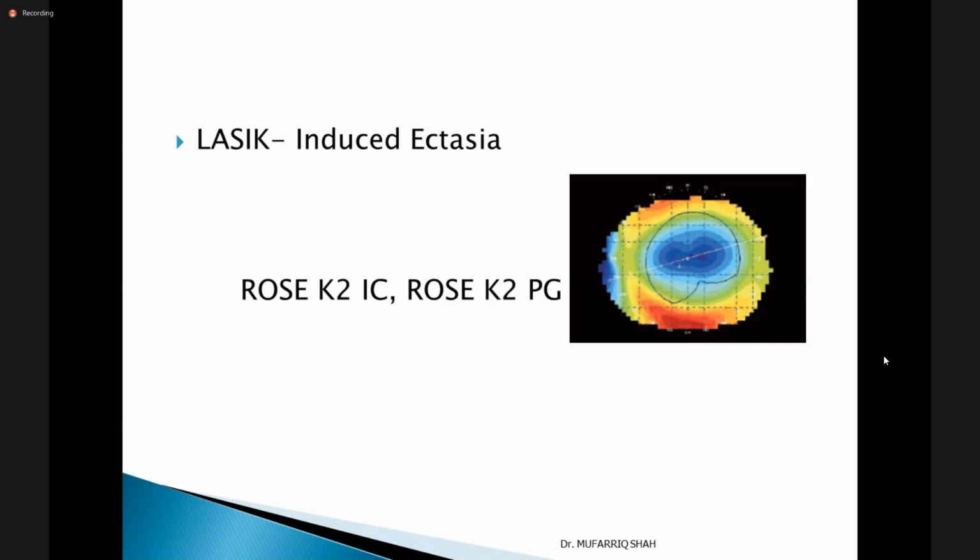So in this case, Rose K2 simple, that is the steeper base curve and smaller diameter lenses, will not work here.